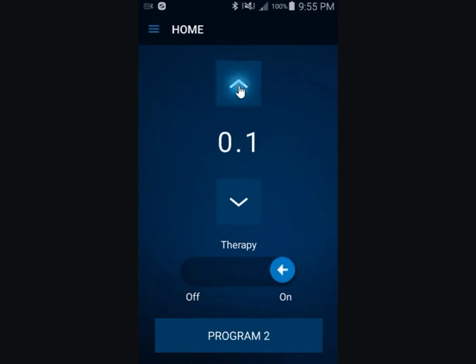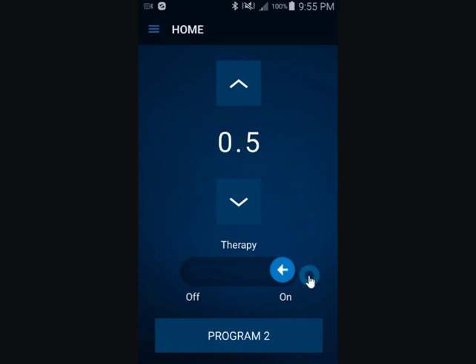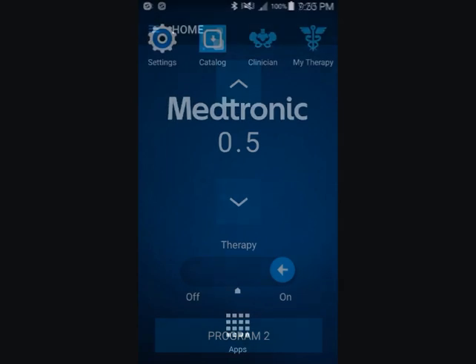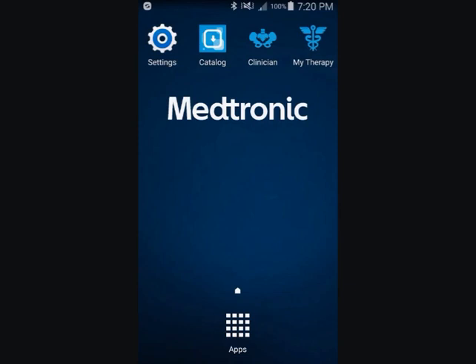Increasing the stimulation automatically turns the stimulation on. Tap the Home button on the programmer to leave the MyTherapy app.